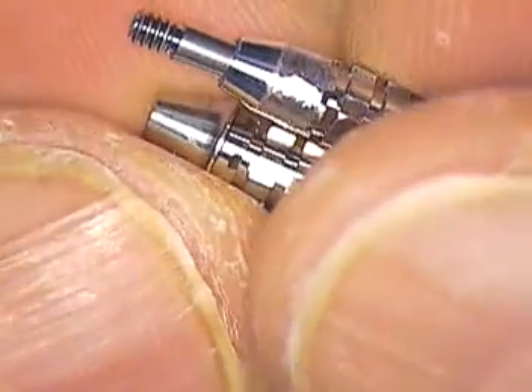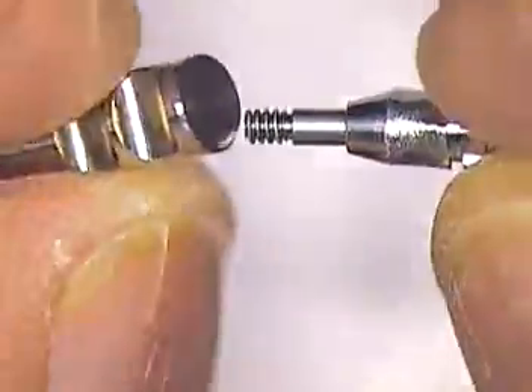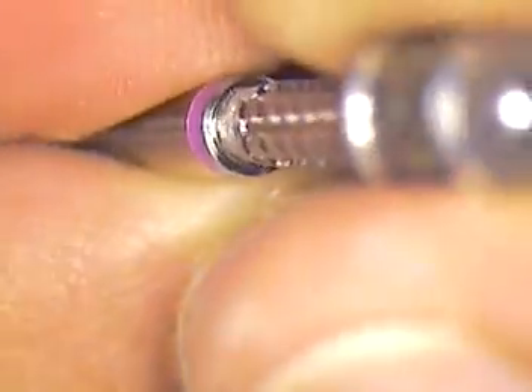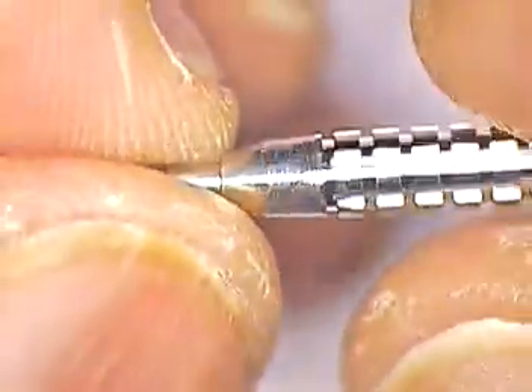I'll show you what that looks like. I've done it, but I didn't do it with the analog in my hand — I did it freehand. To be more precise, take the analog and put it in place. Here is the difference between the two — you can see how much you have to trim away. It's just about to that line. If we put it on the analog, I'm just a little bit underneath. I would go to the line, because when they process the case with composite or acrylic, it won't seep down into the lab analog, and it also won't seep down into the implant in the mouth.